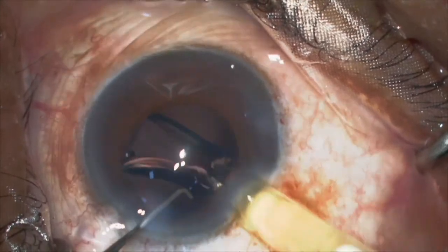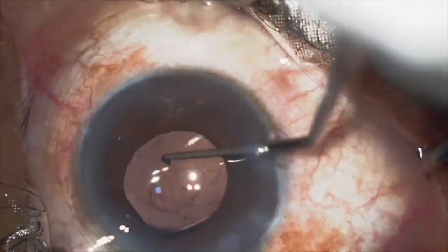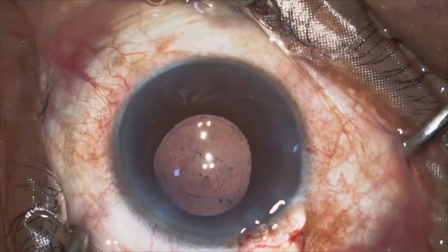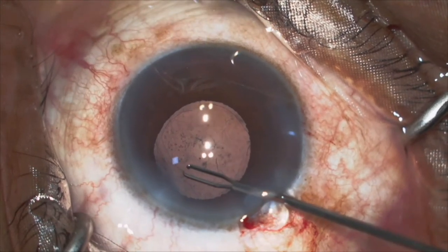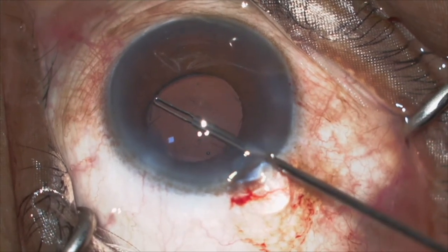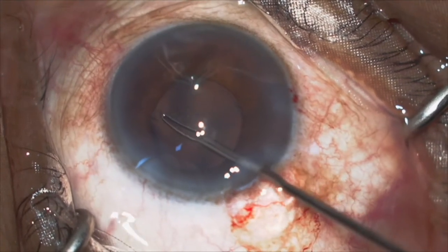In cases where the rhexis is slightly small but big enough to complete the phacoemulsification without damaging the margins, the IOL can be placed and then the rhexis can be extended by making a linear cut using Vannas scissors. Then with the micro rhexis forceps, you can extend the rhexis to the desired amount until the edge of the IOL, so as to prevent any anterior lens capsule phimosis.